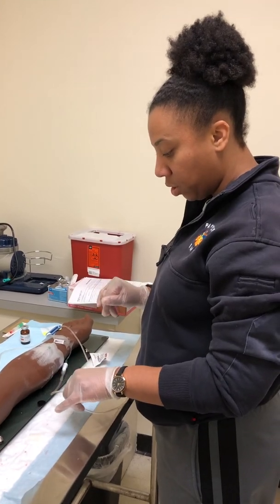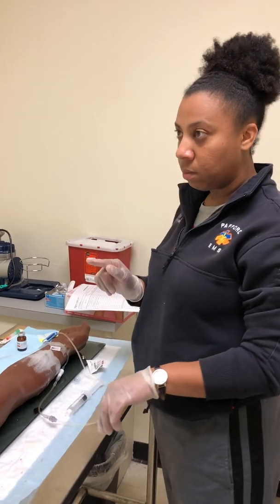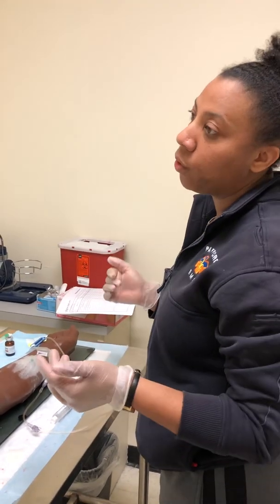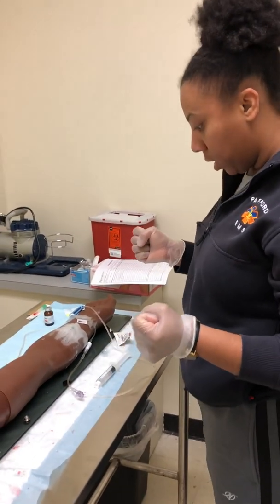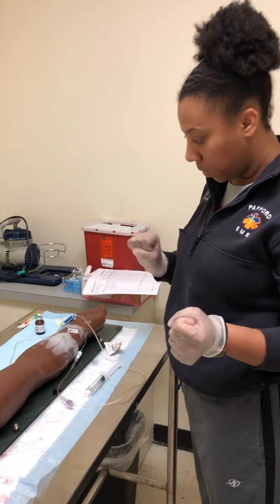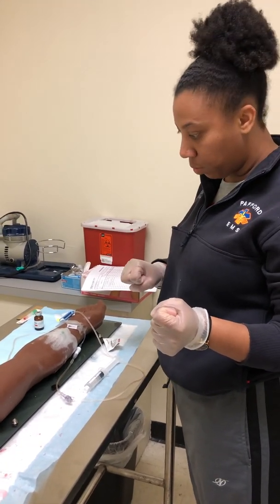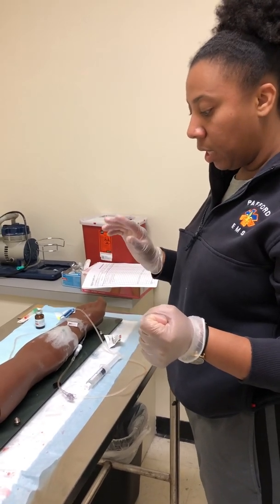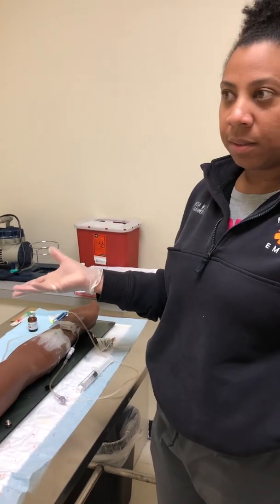I would leave the patient in a comfortable position. Make sure that whatever order they have for their fluids, that they're back at the adjusted rate. And make sure that they're comfortable, that it's still patent, still flowing, and that completes my IV push.